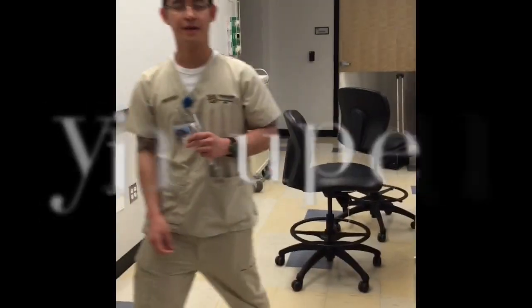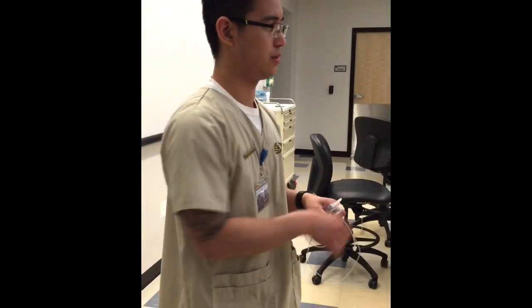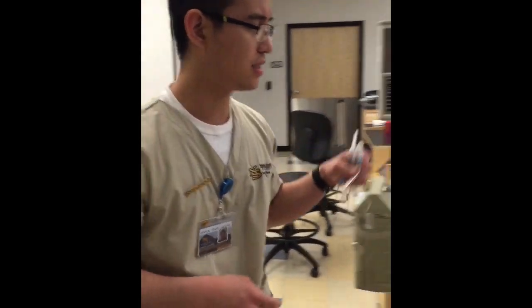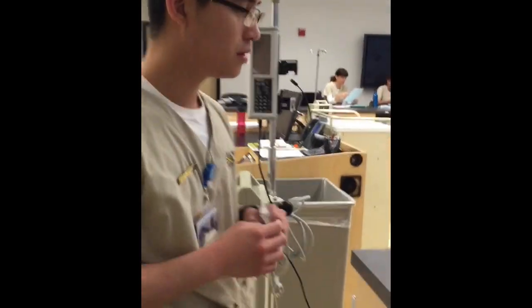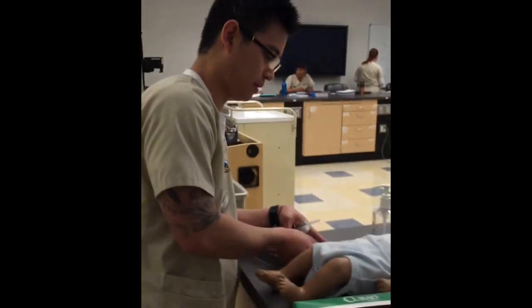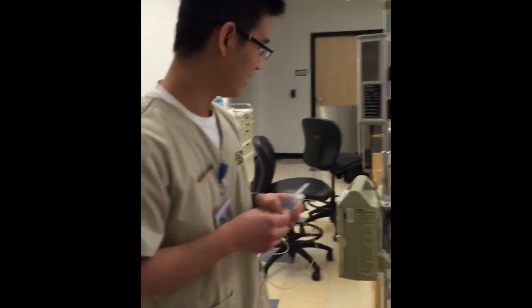Come in. Hi, my name is Michael Arger and I'm a student from Nevada State College and I'm here to administer medication using a syringe pump to your baby. Can you please say his name and date of birth for me? Sure, it's Regina Falangi, 6-25-2013. Thank you — and we'll just double check on the wristband. Your baby is so cute.